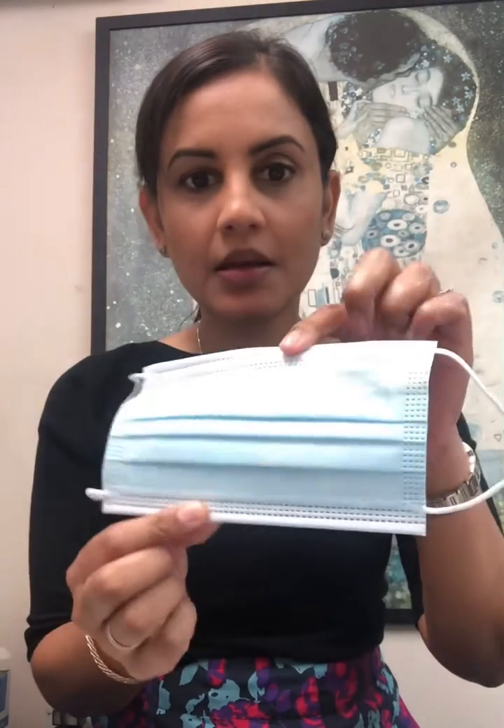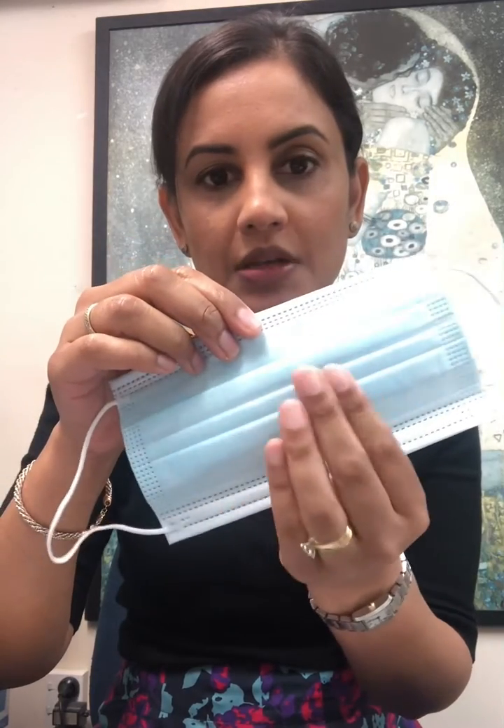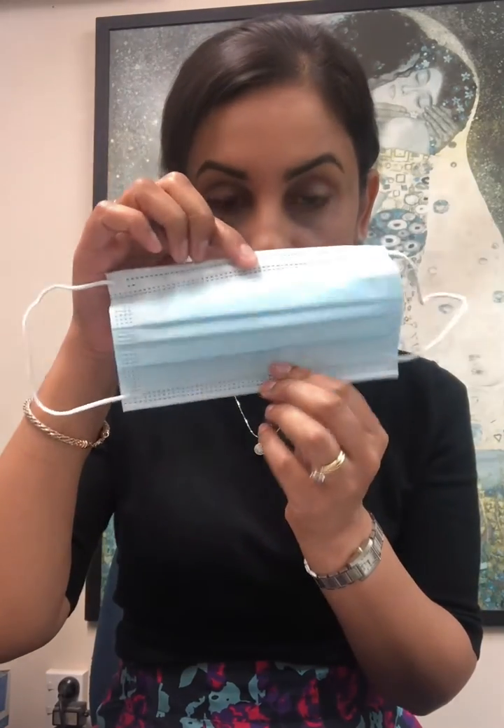These surgical masks have two loops. The blue side is the waterproof layer which goes on the outside, and the wire side is the top — that's the part that will mold to your nose and help prevent your glasses from fogging up.